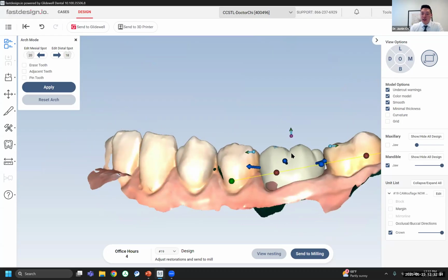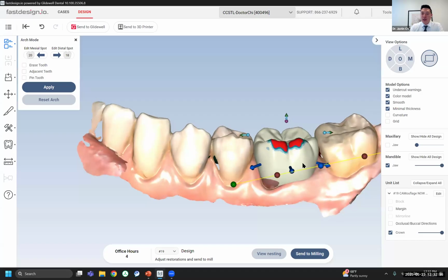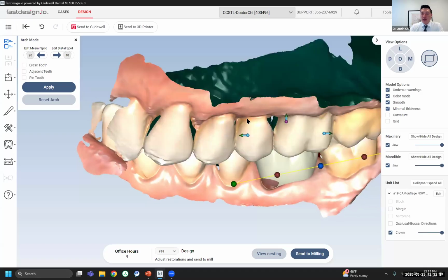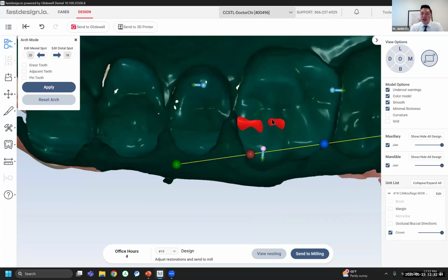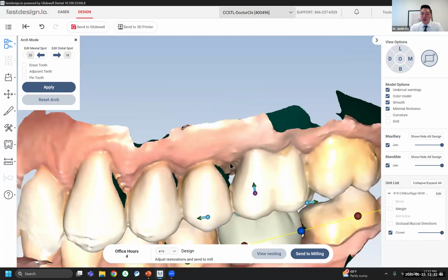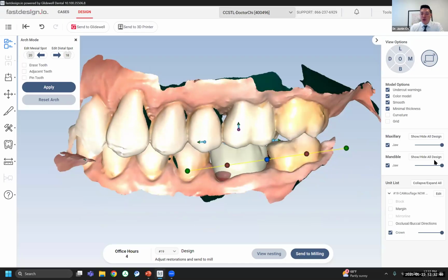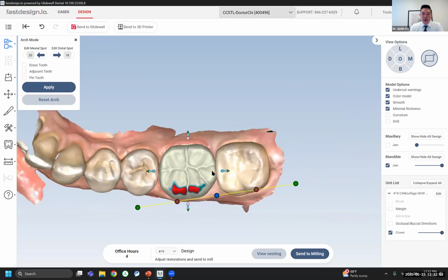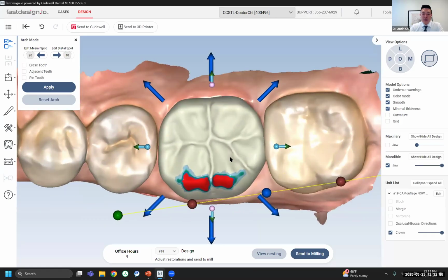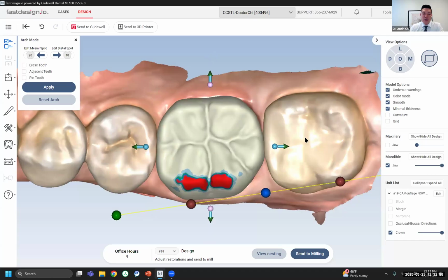Looks like I lowered it a little bit too much, indicated by no occlusal contact. We do want occlusal contact. And we verified that we can even look through the opposing. We can see those cusps coming into the middle area of our opposing. So that's pretty good occlusion and a pretty good starting point for our design. I like to start over at that original bird's eye view, making sure the tooth is centered between the adjacent teeth and centered over the prep.